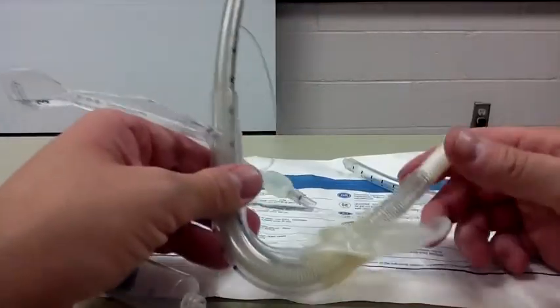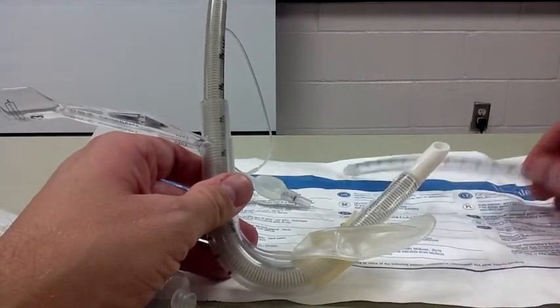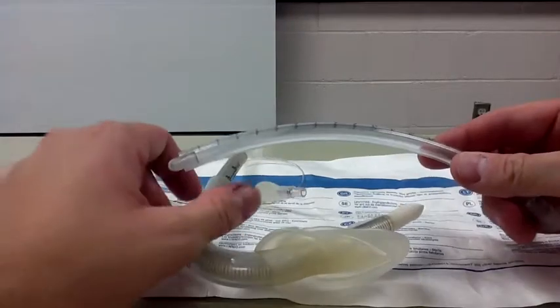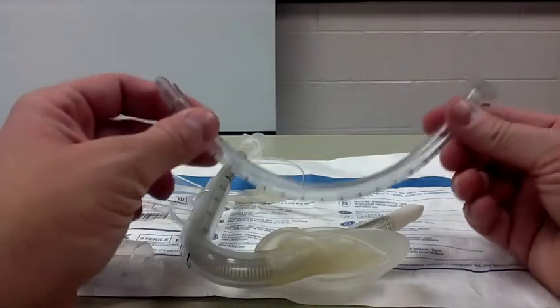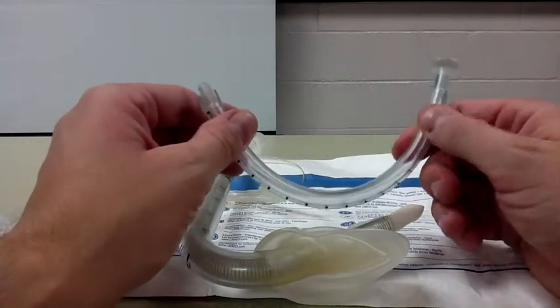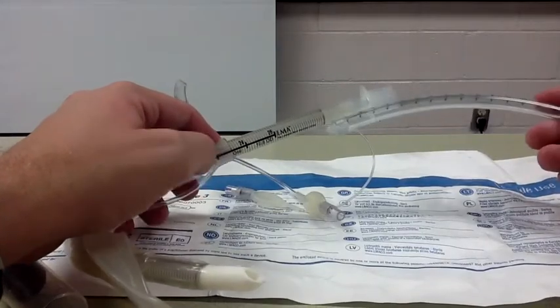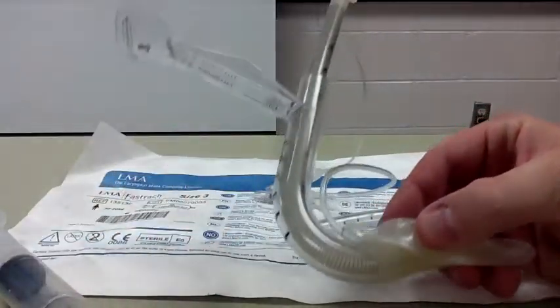Although I wouldn't necessarily recommend doing this in the pre-hospital environment — you'll more likely see it in the hospital — there is a small support stick that comes with the package. This is used to stabilize the endotracheal tube and actually pull the LMA out. I'll demonstrate that maneuver in just a minute.